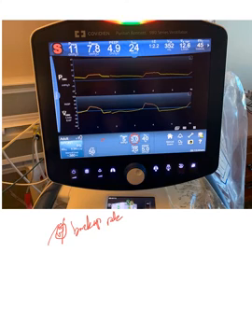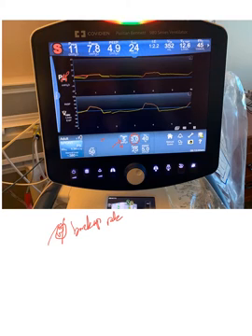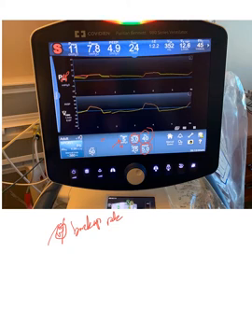The target, as you see, is a pressure target. We ask the ventilator to give five centimeters H2O during inspiration. So five plus five — the ventilator fulfills this by making the proximal airway pressure at 10 centimeters H2O, basically five on top of the PEEP of five.